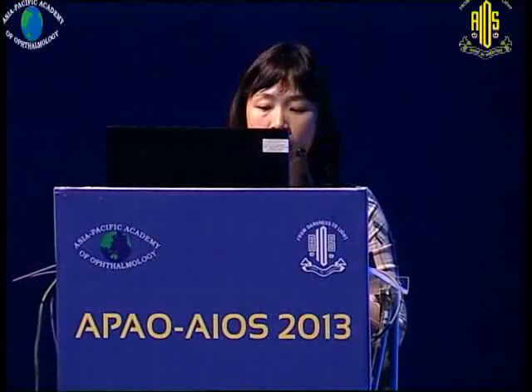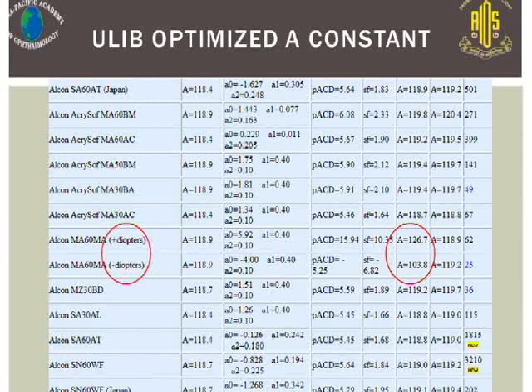Just an interesting point from the ULIB website. For patients with extreme myopia, even though the IOL Master allows more accurate measurements of the axial length, we still get hyperopic refractive surprise. The reason is that the negative diopter intraocular lenses are concave in design, whereas the positive diopter intraocular lenses are convex in design, and are therefore theoretically two different types of intraocular lenses warranting different A constants.